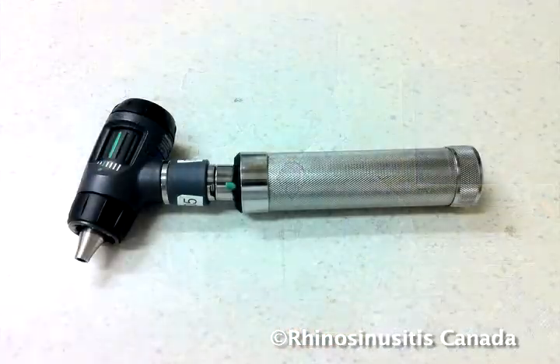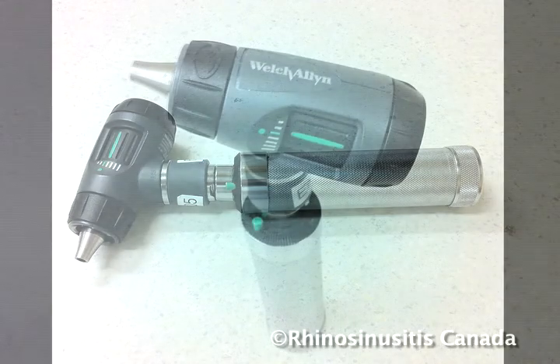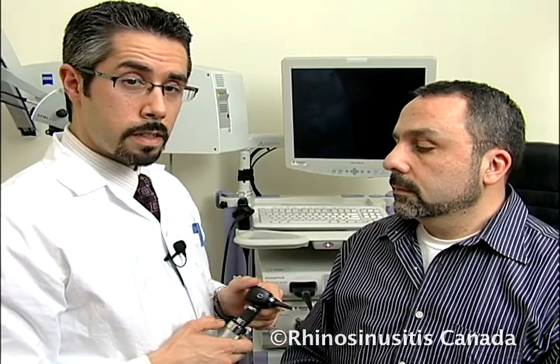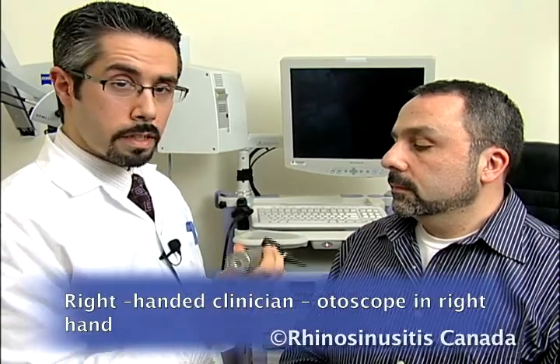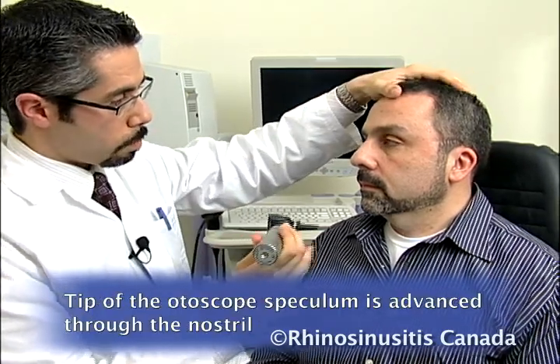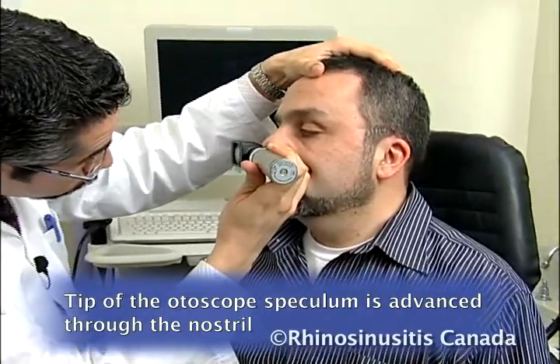Alternatively, the illumination and magnification provided by the current generation of otoscopes allow good visualization of the internal nasal structures, and thus the otoscope can also be used to examine the nasal cavity quite effectively. In this instance, the otoscope is held in the right hand for a right-handed clinician, and the tip of the otoscope can be passed through the nostril in order to examine the internal nasal structures.